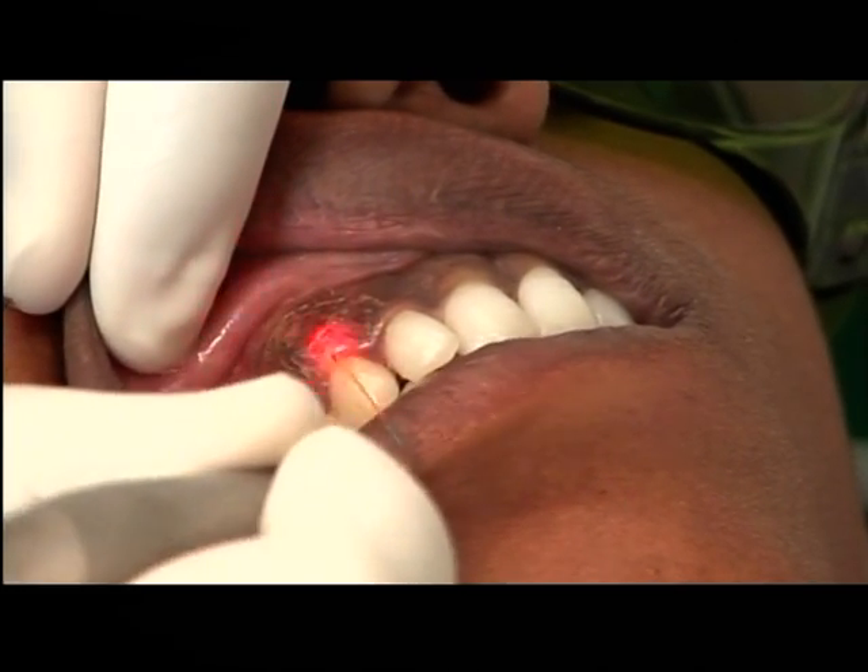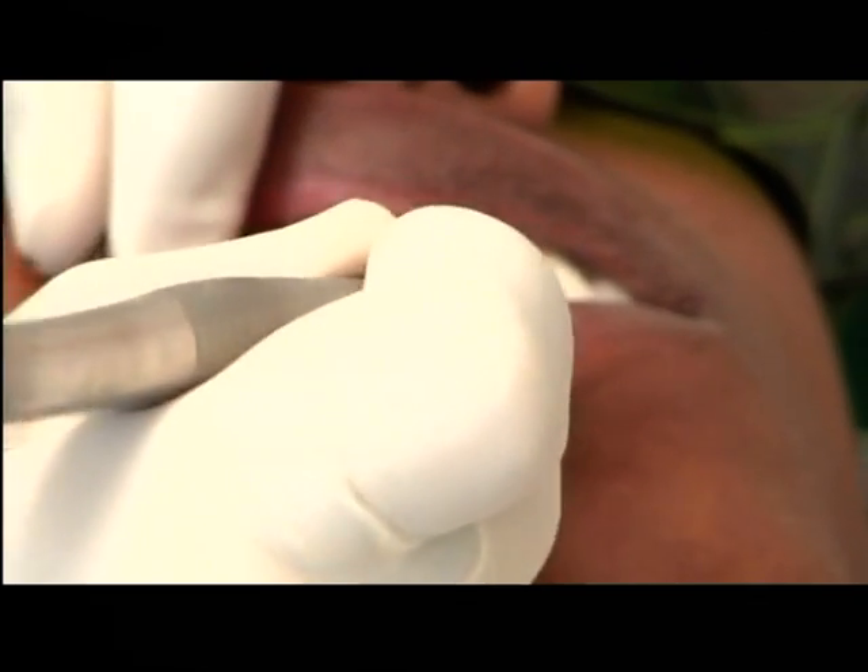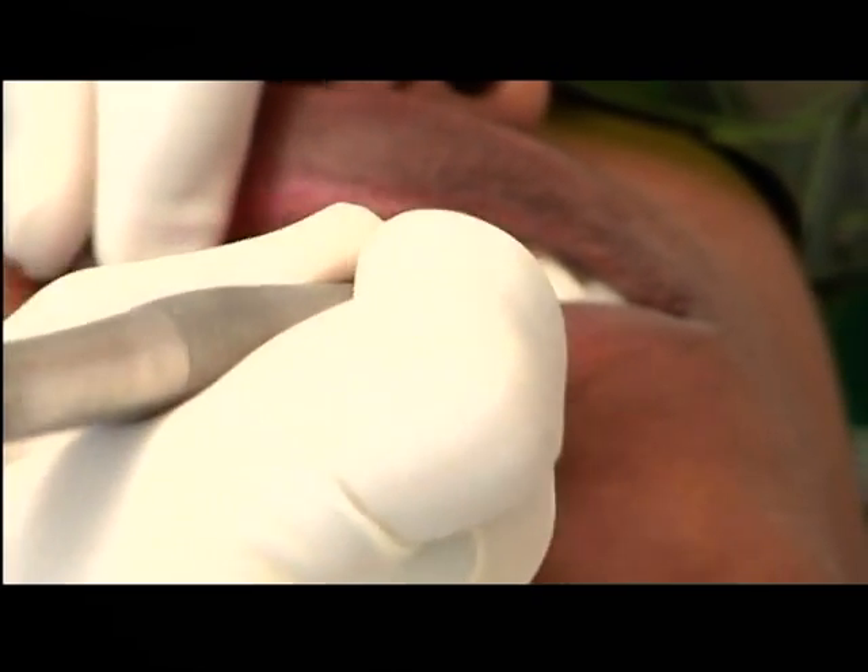And what are the power settings? Two watts, continuous wave and contact mode. As you can see, I'm only making a sweeping action.